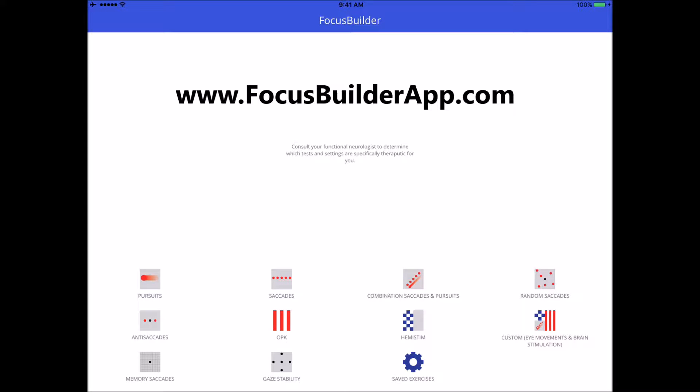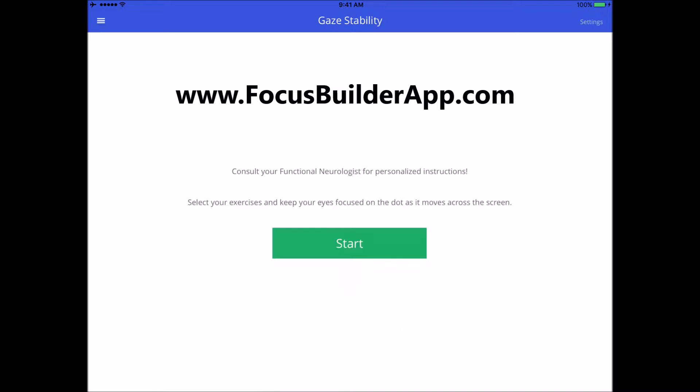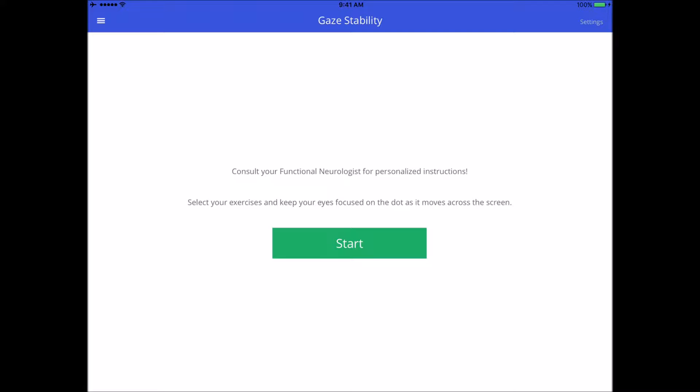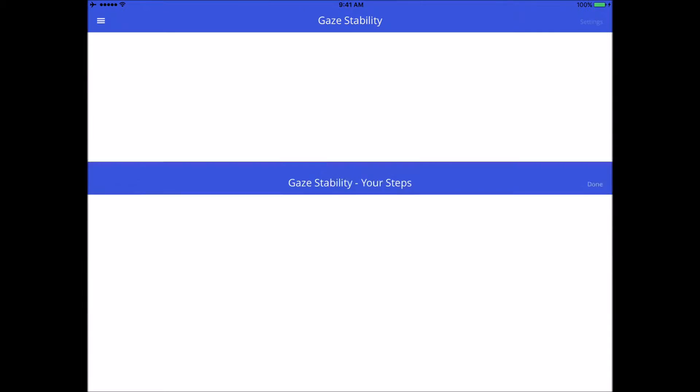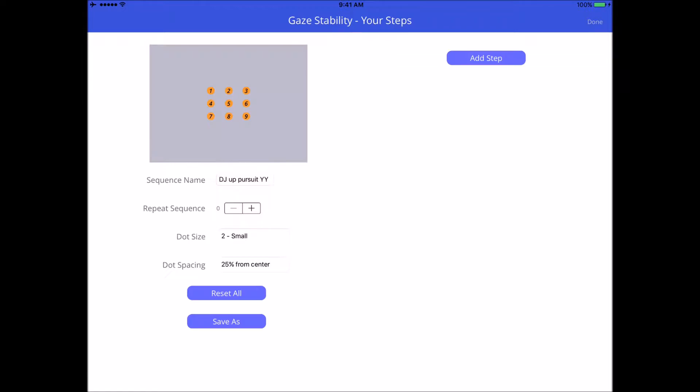The gaze stability exercise and focus builder is probably the most labor-intensive option that we have in our app to create. The amount of resources it took to create this has been absolutely tremendous, so we're very proud of what we've done and I'm going to take the time to take you through exactly how it works.